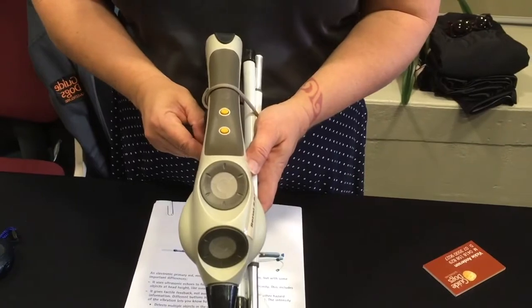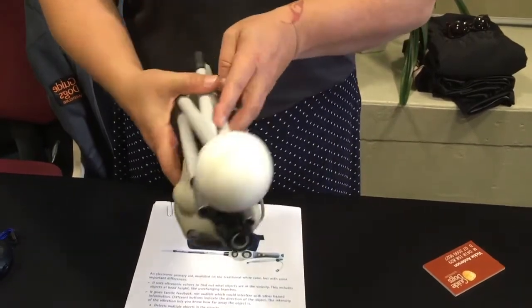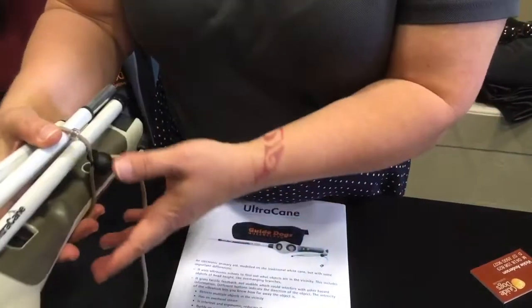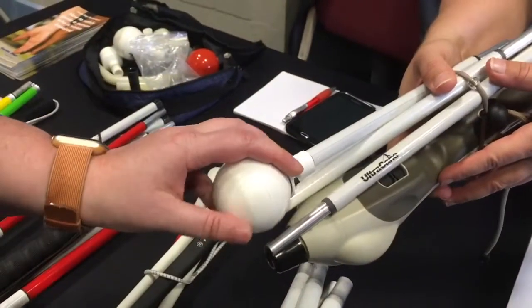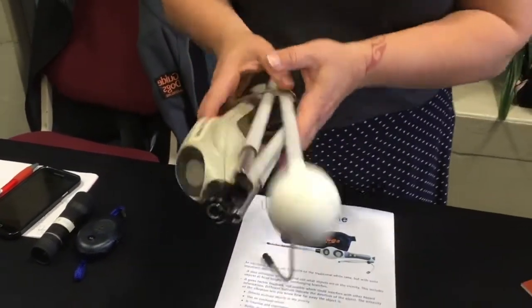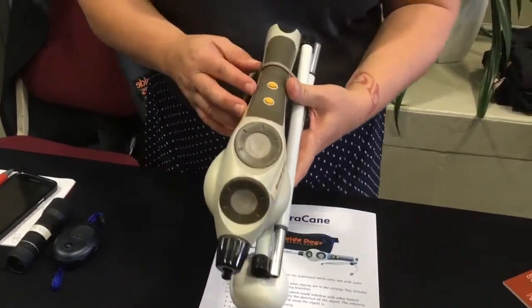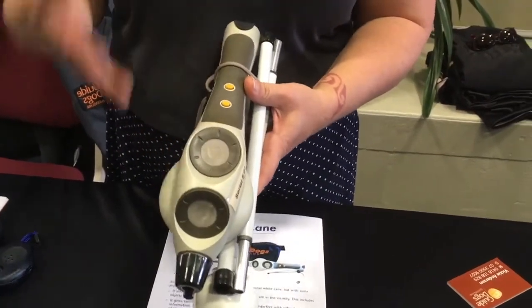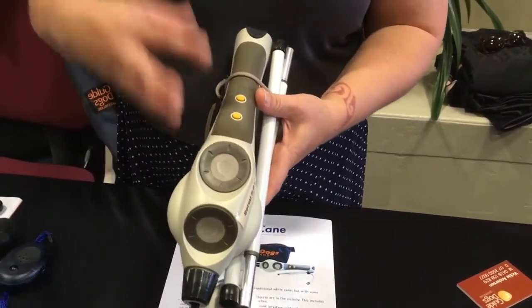As for the tip, they all come with the big round jumbo ball. We are also currently looking at testing out other canes that have the same sonar technology but in a different form factor.